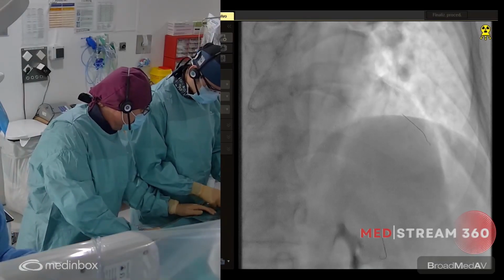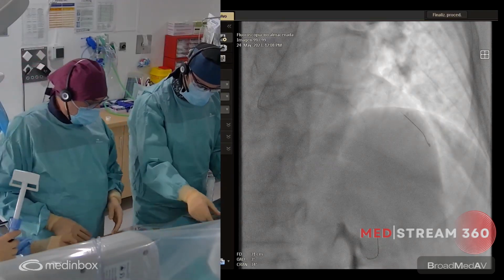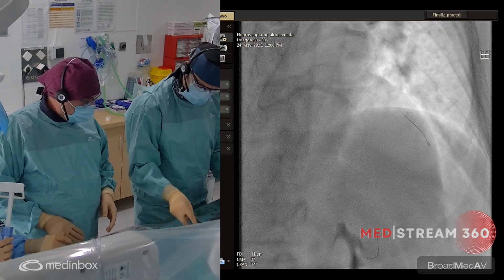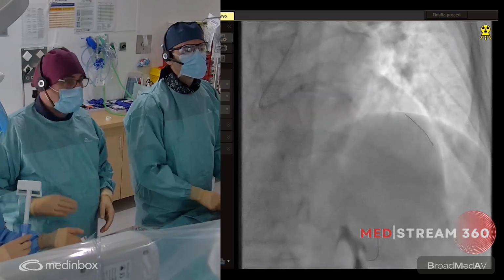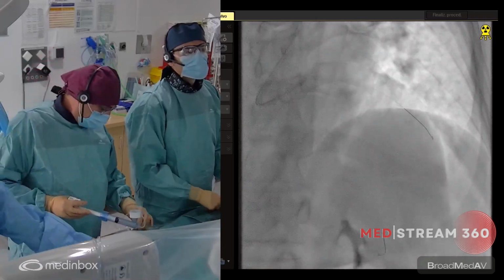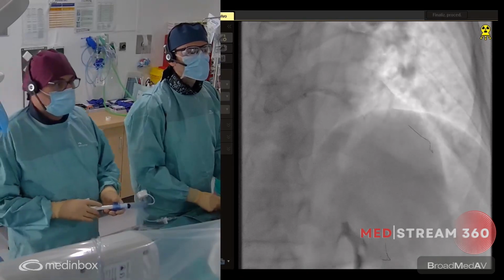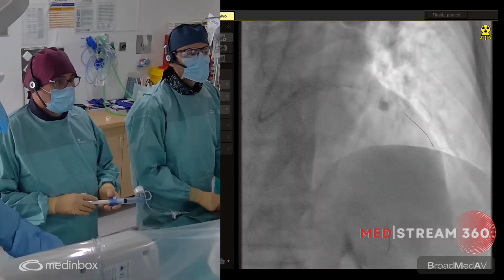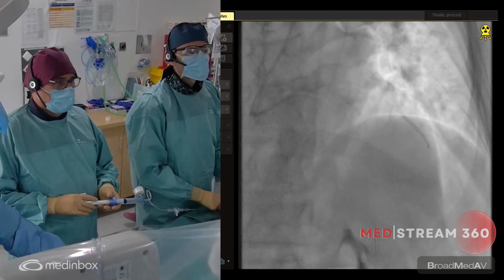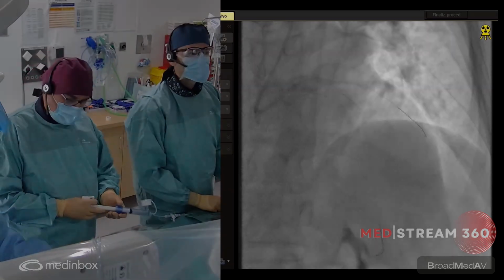Discussing this, the third diagonal is the third diagonal, not the first one, but it also has some stenosis at the ostium. And if we land the stent before this branch, it's a good option to preserve it. But the lesion that we have seen in the OCT distal to the third diagonal, probably we need to treat it.